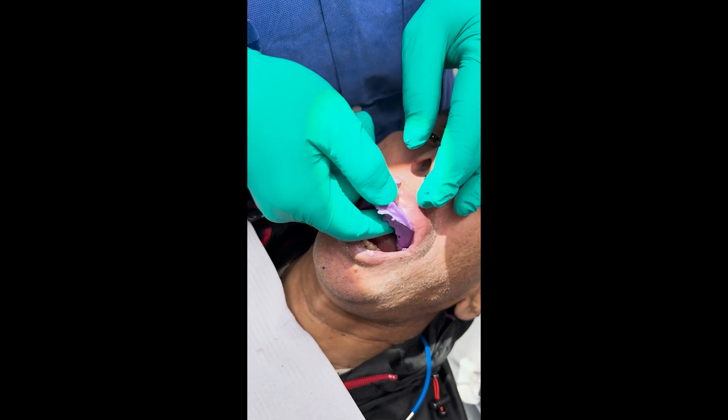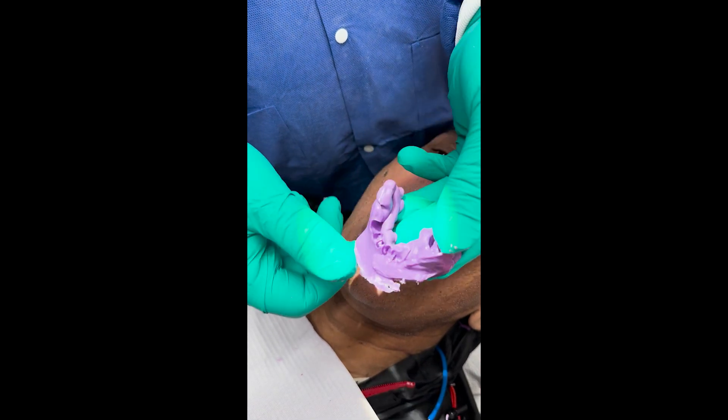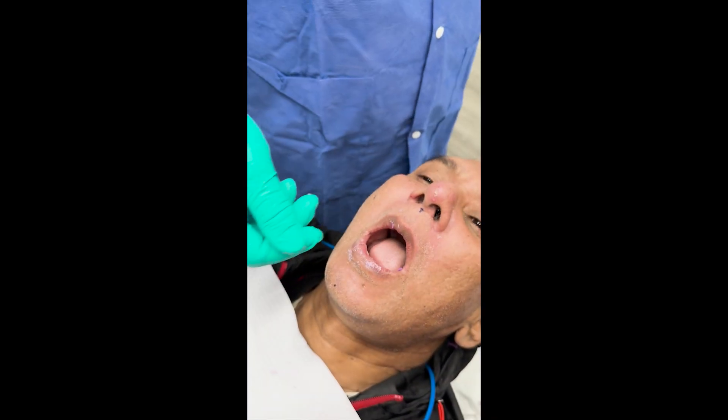Here's our bite and we've got our opposing really nice. Now we're going to stick this denture back in and see how close we are.